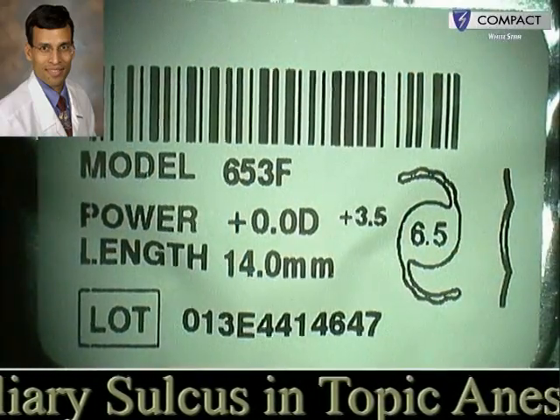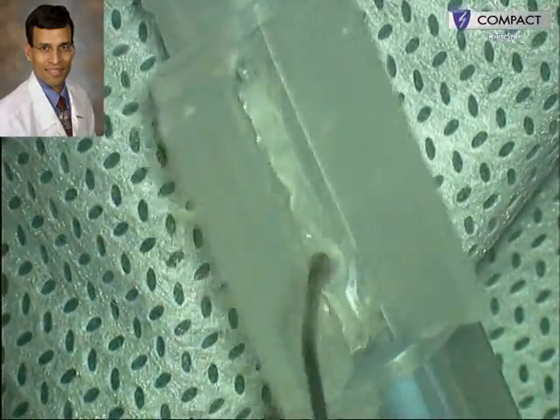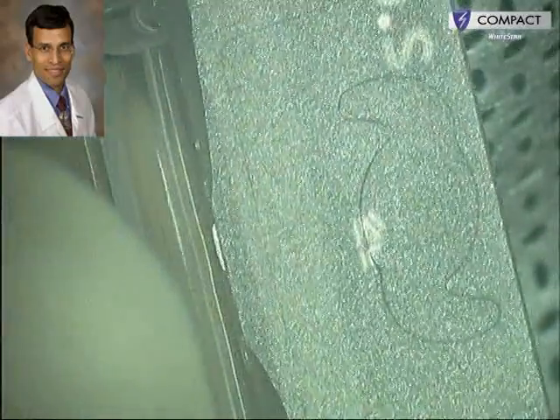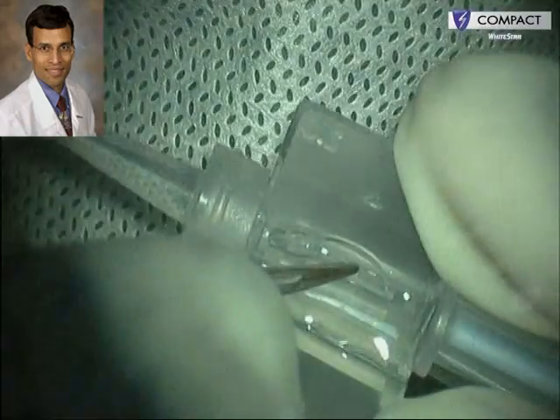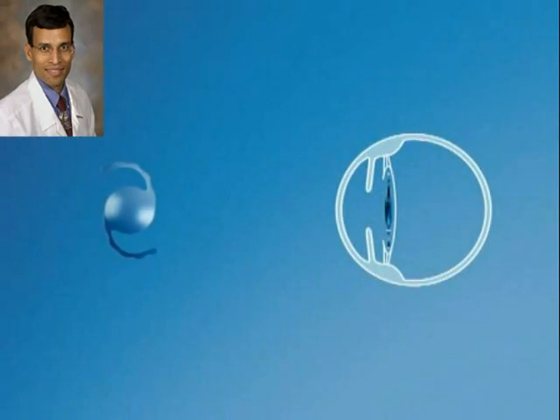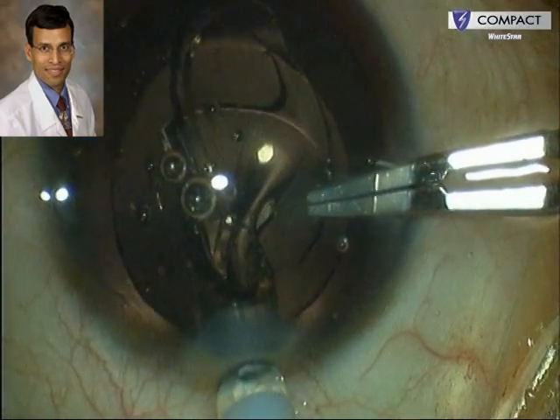In this case we are implanting a plus 0 diopter multifocal lens in a young patient with a developmental cataract. Initially a monofocal IOL was implanted because of the possibility of amblyopia, but the patient achieved very good distance vision. Therefore, to achieve spectacle independence, a 0 diopter multifocal IOL with a plus 3.5 diopter add was implanted to provide near vision as well. This is the specifically designed Sulcoflex IOL for implantation in the ciliary sulcus — it has a round edge and undulating haptics which minimize the chances of iris chafing. This hydrophilic acrylic IOL is now placed in the ciliary sulcus on top of a hydrophobic acrylic IOL previously implanted in the capsular bag.